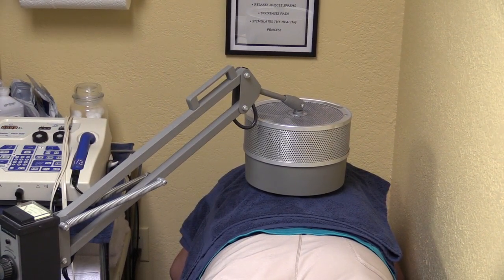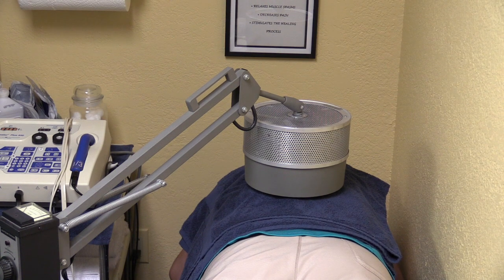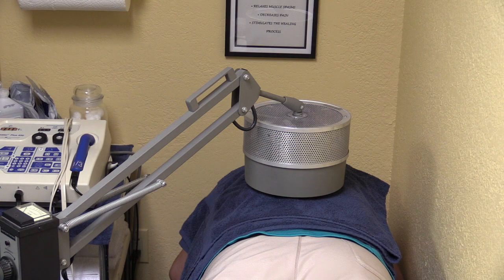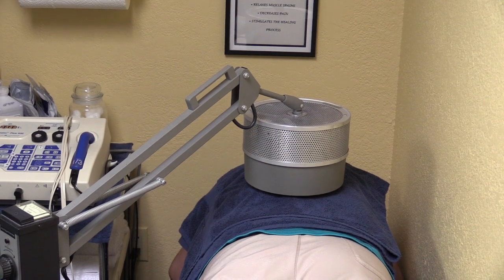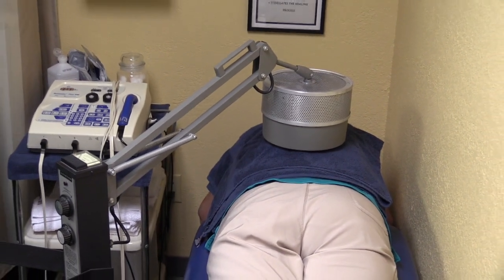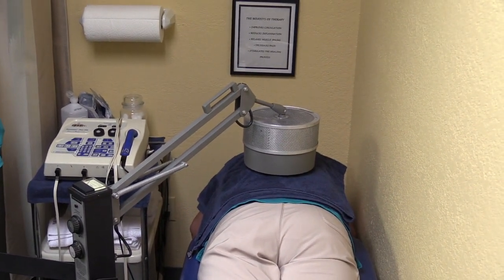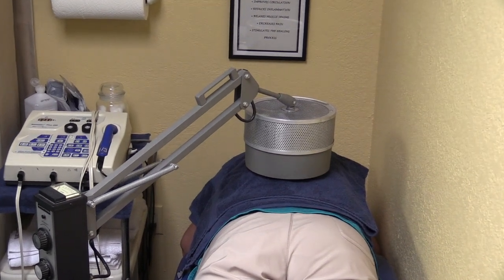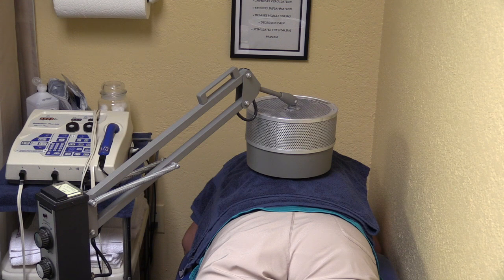That will produce deep heat by vibrating the tissue. The tissue vibrating causes the heat that will cause circulation to increase. It can be used to help decrease swelling, decrease muscle spasm. It's effective for decreasing pain in areas and speeding up the healing process. It's commonly used for sprains and strains, which are damage to muscle or damage to ligaments and tendons.